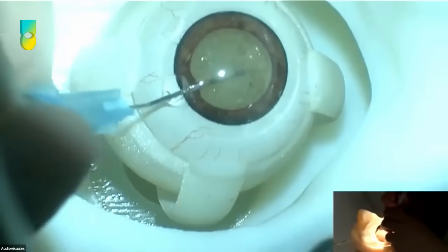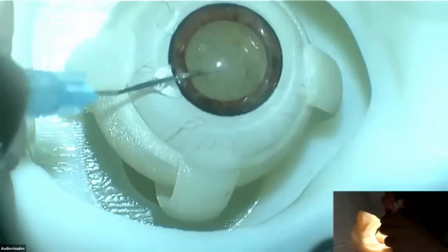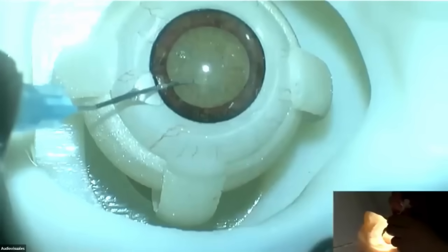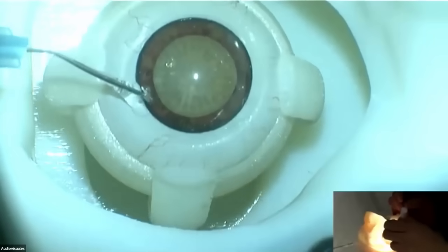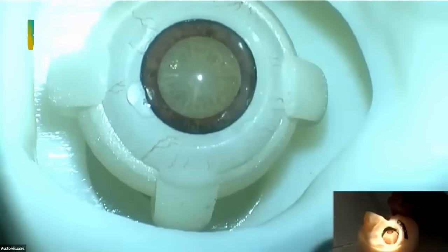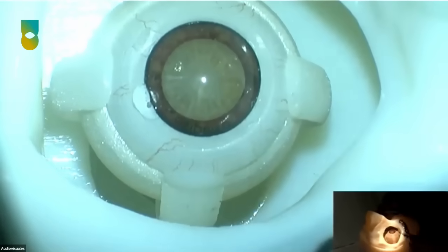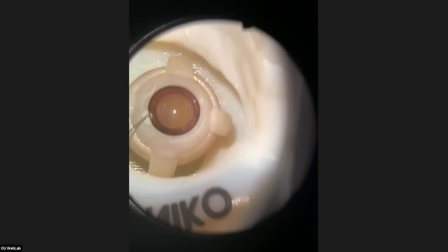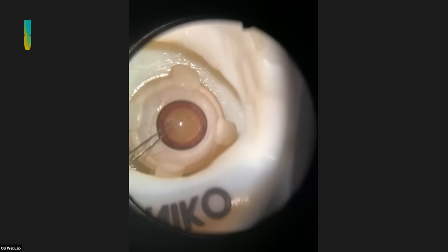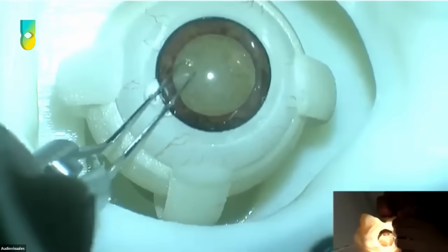Perfect. And as you can see here, those concepts I was talking about started to show up, right? We had an eye that was completely stable. So now, every time she moves through the incision, and remember, guys, the limits, if she doesn't respect the limits and she doesn't pivot, the eye is going to move. And this eye is going to move a lot. But that's a good thing. Why? Because I want all the residents to train how that eye is going to behave in real life. So I think this is going to be a great experience.